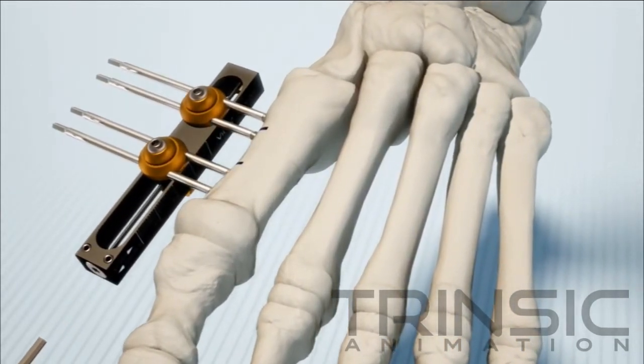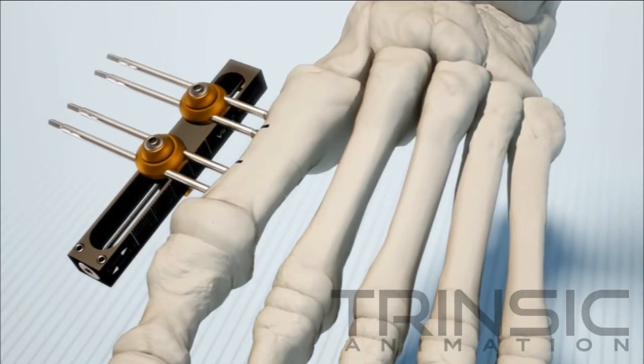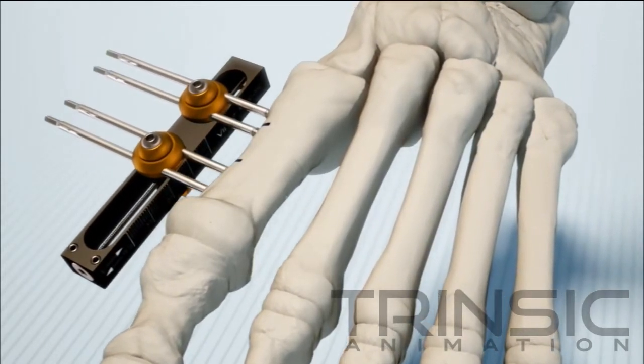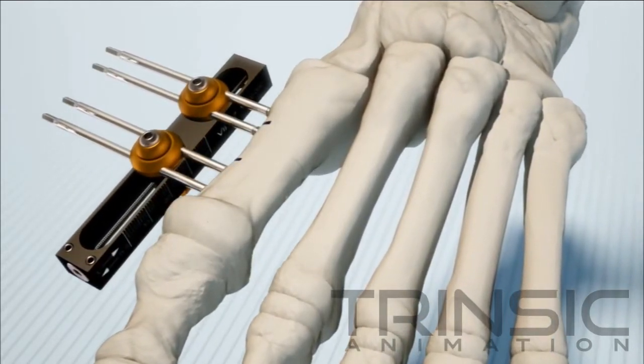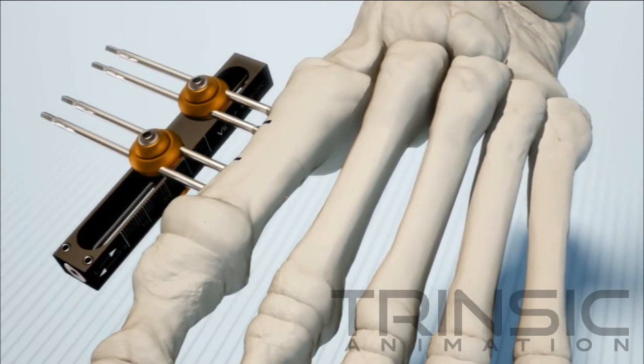To initiate osteogenesis, begin by compressing the osteotomy firmly for a few days before controlled distraction is initiated. Close and suture normally.